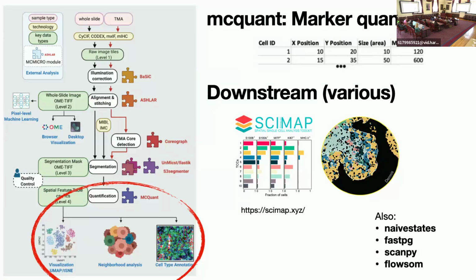We've thought about running more of the CellProfiler approach of measure as many properties as you possibly can, and then just sort it out later. These files with 30 to 60 channels are already getting really big, and so we might want to be a bit more thoughtful about this, but we should probably be more judicious about what markers are useful. I know that kind of defeats the purpose of, I saw Beth's talk the other week, and I've seen Anne talk many times about this approach of just measure everything and sort it out. But the data size does actually really start to hit you if you start to do that on these images.